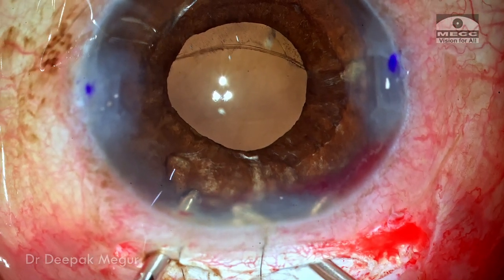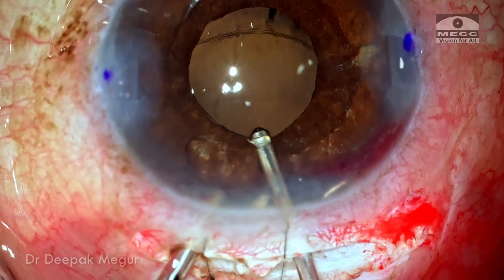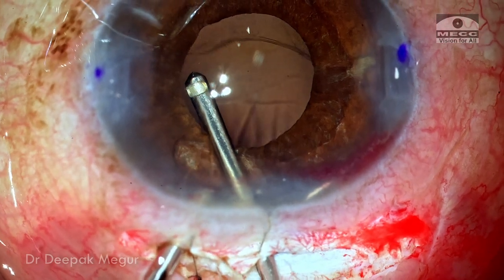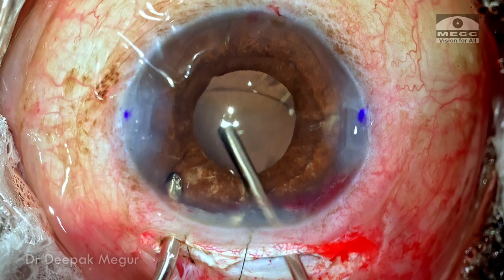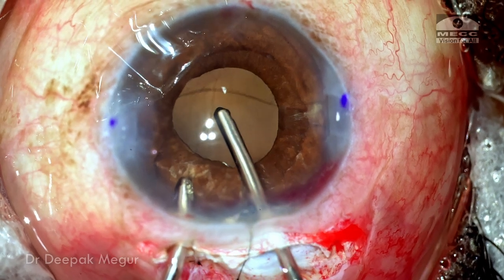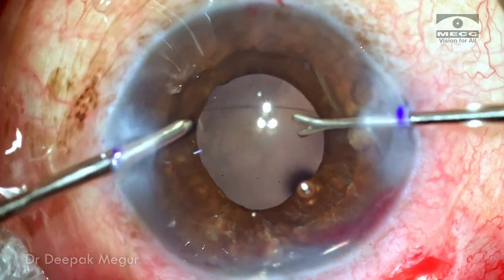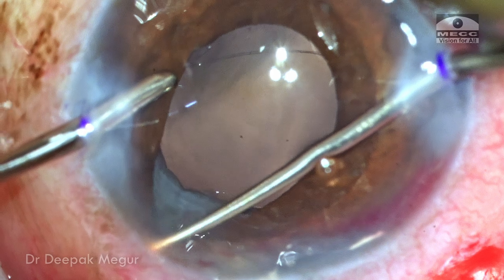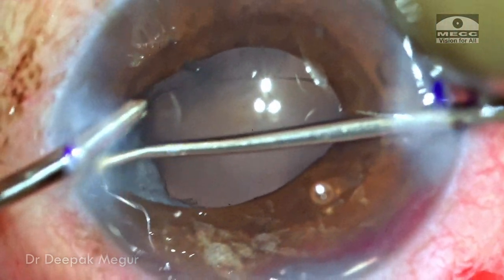These fibers are already cut and have no connection with the posterior vitreous base, but each must be removed. Using linear cut mode is very helpful — I can cut individual vitreous fibers without causing collateral damage to the underlying iris. Continuing the anterior vitrectomy using irrigation and cutting through the main wound. The pupil has come down in size. I'm using a Y-hook to retract the superior iris to understand the presence of the anterior capsule. There is thick underlying lens material inside which needs to be addressed before placing the intraocular lens.